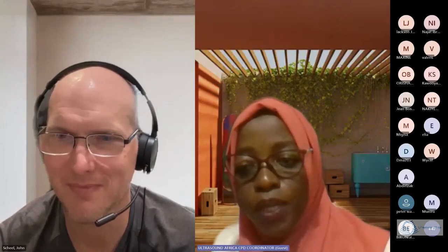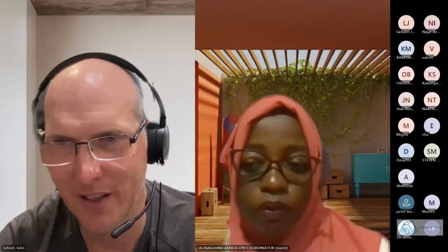Thanks a lot, Prof. Do we still grade breast edema using the BI-RADS system? And if so, which grade does it qualify? Thank you. That is Dima asking. That's a good question. So breast edema is an associated feature. And so if it's just edema, it would be BI-RADS 2 typically, because you wouldn't biopsy breast edema.